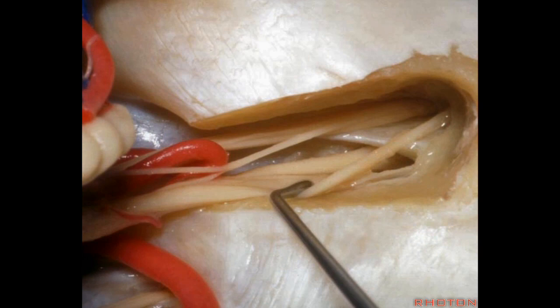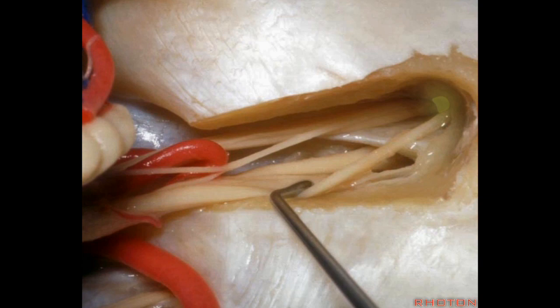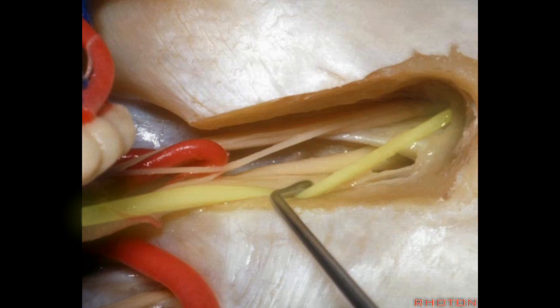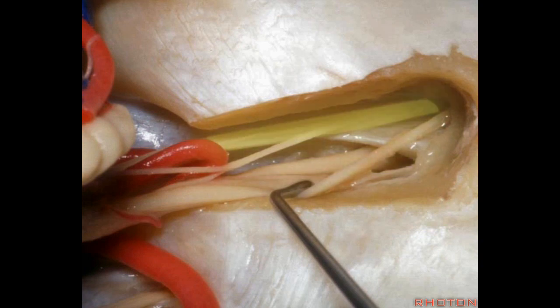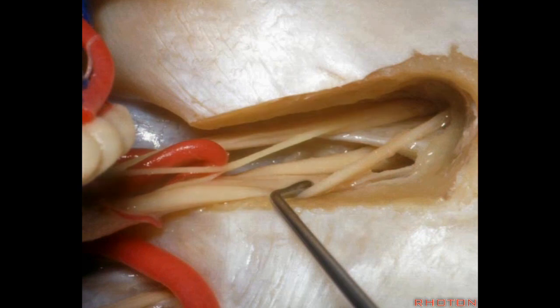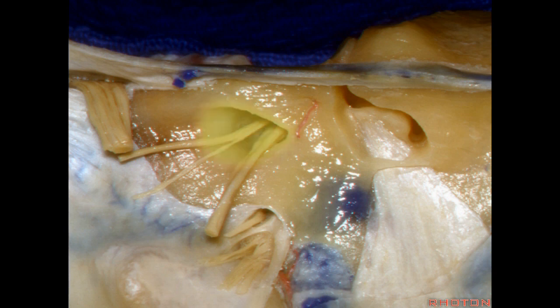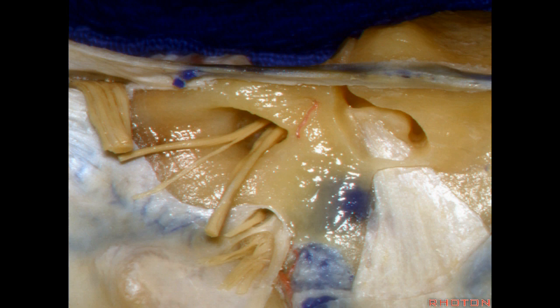Here we're looking in from the back, and this is Bill's bar: superior vestibular, inferior vestibular, cochlear, facial, and intermedius. Now, if you drill lateral to the porous of the meatus — if the pathology goes into the vestibule or the canals and hearing is lost — you can drill all the way lateral into the vestibule.